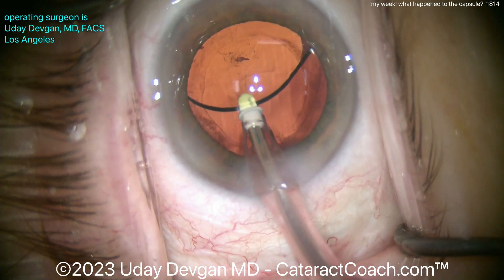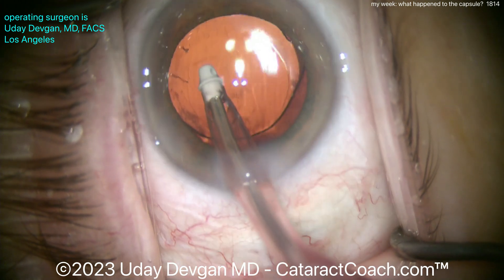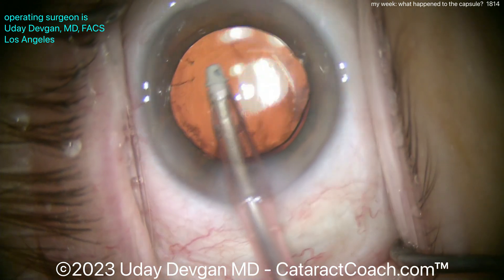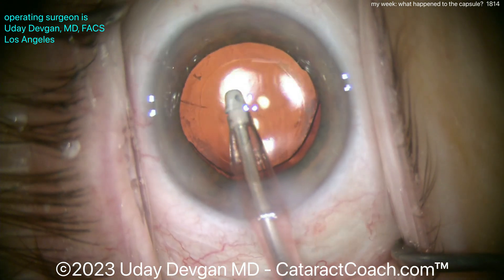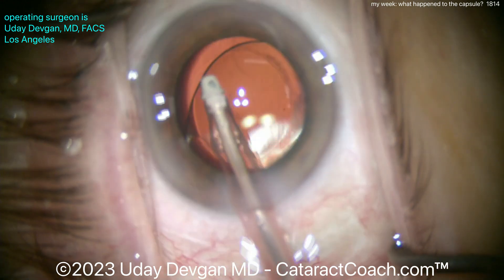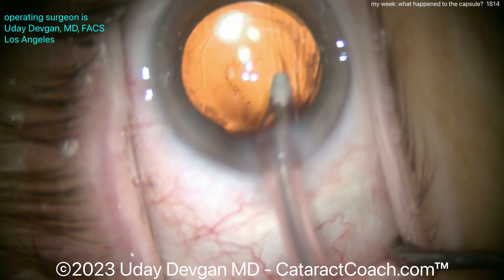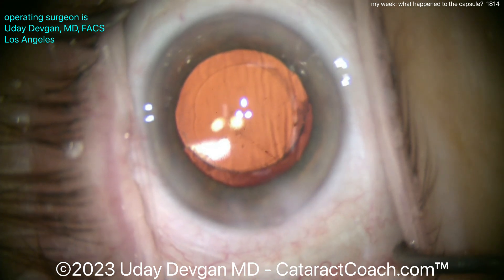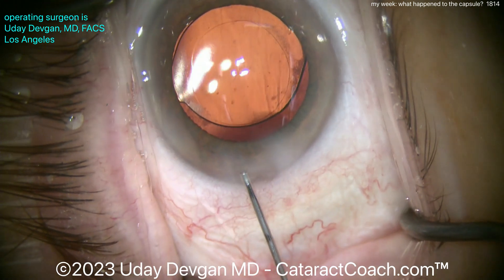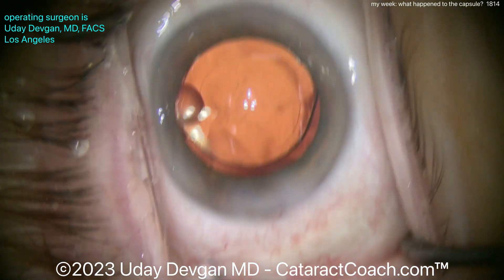Do remember — look carefully — you'll see some material in the anterior hyaloid space: material that went through the capsular bag via the deficient zonular support and behind the posterior capsule. That's another indication of laxity in the capsular bag. Those fragments will all dissolve in the inflammatory cascade, so the patient will certainly need some post-op steroids.